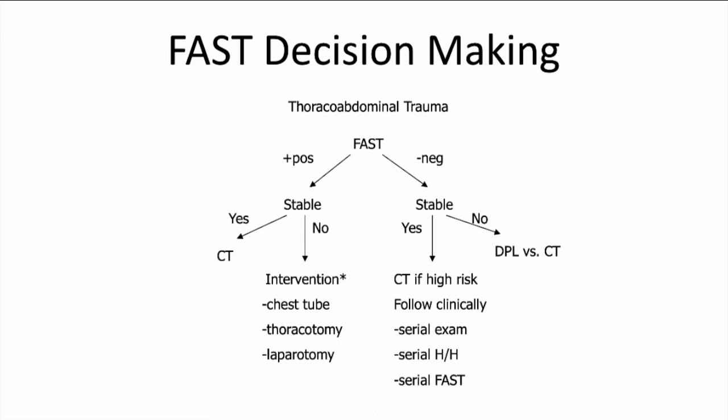Obviously, that's going to depend a little bit on your clinical scenario. You're going to be discussing that patient with surgical consultants, so I don't want to make any definitive statements or prescribe any specific clinical care, but there are some settings where penetrating abdominal trauma does not always require immediate laparotomy, and the FAST exam can help a little bit with some of that decision making. A little bit beyond our scope, but something to think about.